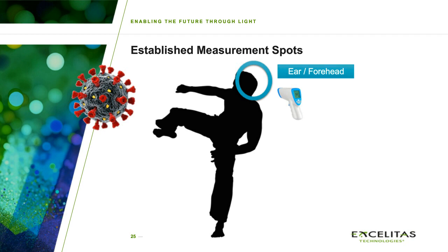Okay, this is a follow-up question to an earlier question that you answered. At a distance of 1 meter, the view of the sensor includes a large background around the face of the person. If the temperature of the ambient is higher, can the sensor still detect the temperature of the face? Perhaps the issue is for the software to identify the hottest point, which may be the ambient and not the face?